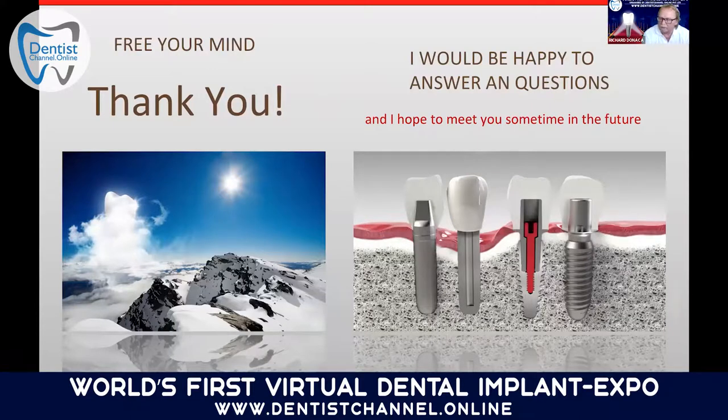I must say the best book probably on conical connections, there is no real book on conical connections. Of course, a company like Bicon is also a conical connection that has been, I think, 30 or 40 years on the market with a 1.5 degree taper. There are other, smaller companies on the market also doing 1.5 degree taper connections now.